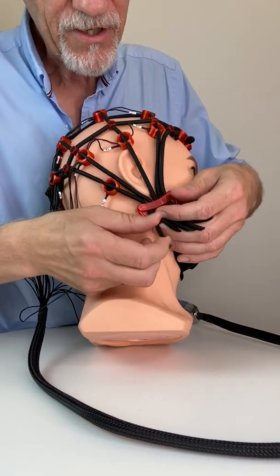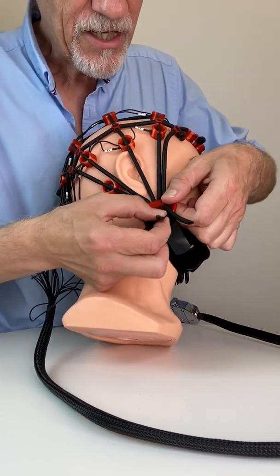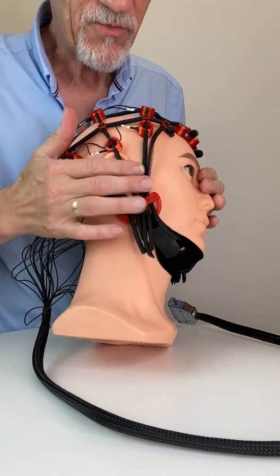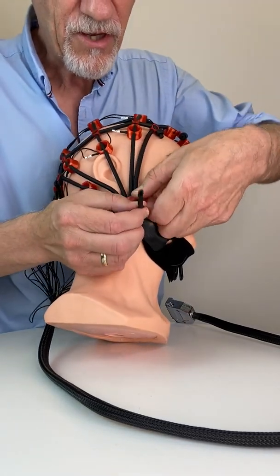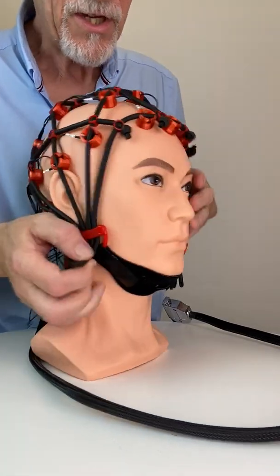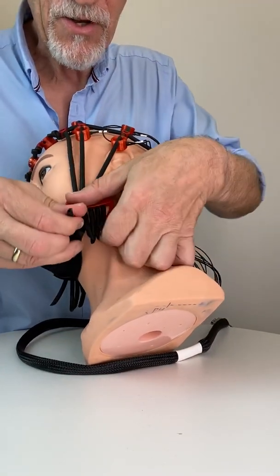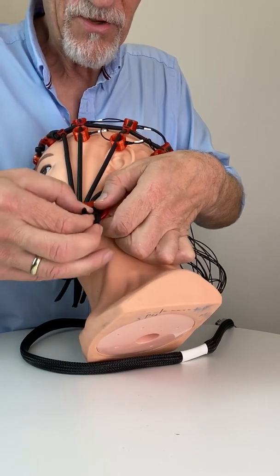A little bit more here, a little bit more there. I do this very slowly now — later on you will see that it goes pretty fast. Still too loose, we will pull a little bit more here. Go to the other side and pull as much so that there are no loose strings or loose tubes any longer.